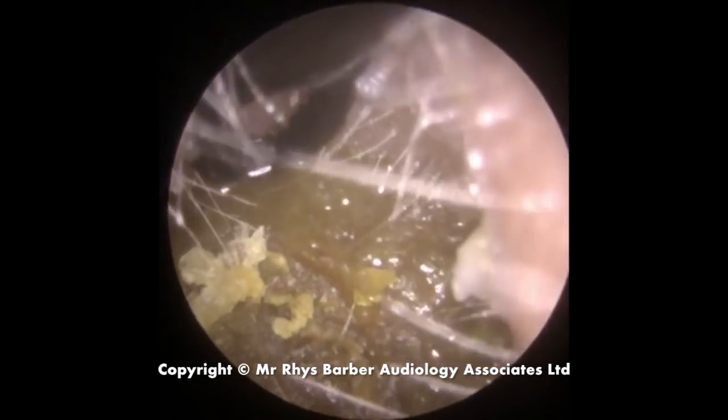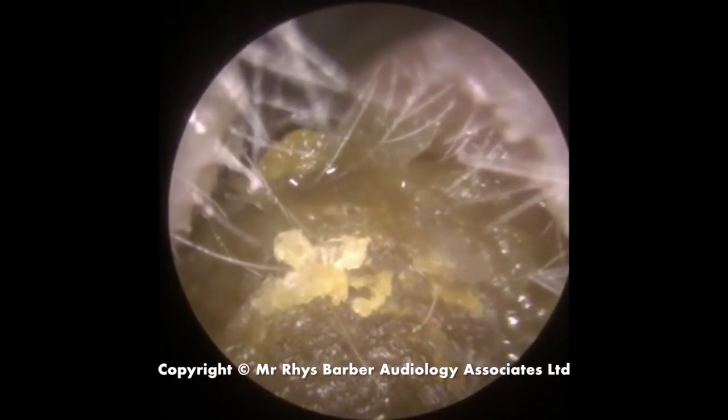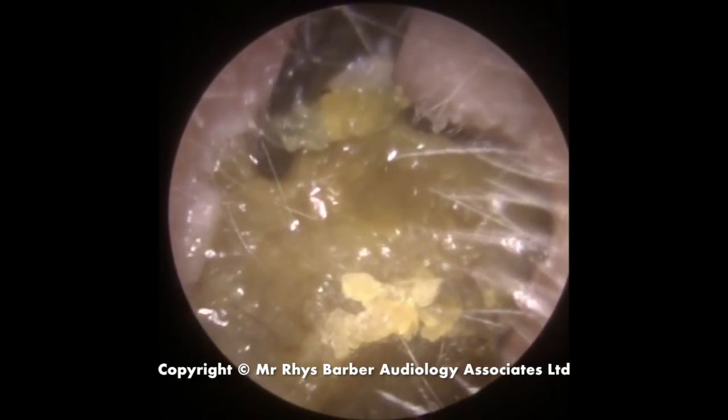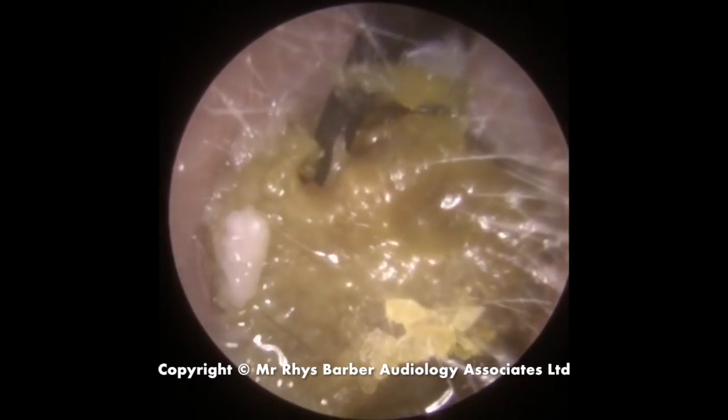Just put a little bit of olive oil in there to help lubricate the wax on its way out, because it's quite a large plug. It's more comfortable for the patient if you use a little bit of olive oil, and it makes the extraction a little bit easier as well.